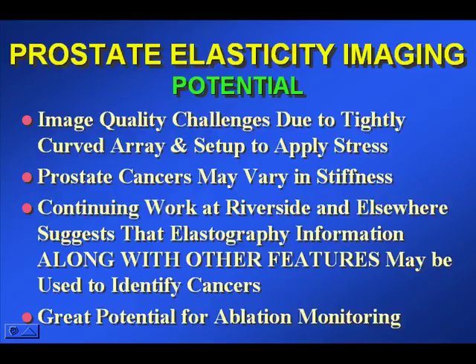But continuing work at Riverside and elsewhere suggests that if you combine elastography with other features, perhaps even high-field MR, the identification of cancers may be quite reliable. And of course, it's a great method for ablation monitoring if you decide to treat the prostate cancer with ablation rather than surgery or radiation.